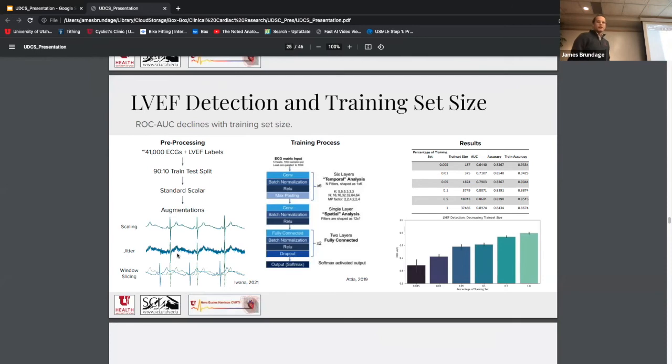So from there, we chose to try to use Mayo Clinic's architecture that they had published. And we ended up having a similarly sized training set, although their test set was much larger. And so we really tried to do as close as we could with our data to replicate what they had done. We were excited because we were successful at that. So Mayo Clinic achieved an AUC of 0.9 and we were able to achieve an AUC of, it's not showing up super well on the screen here, but an AUC of 0.89. So we were really close to approximating what they had done.